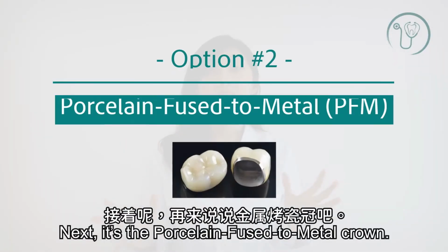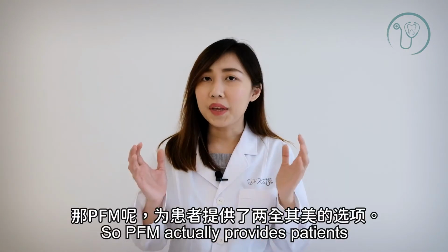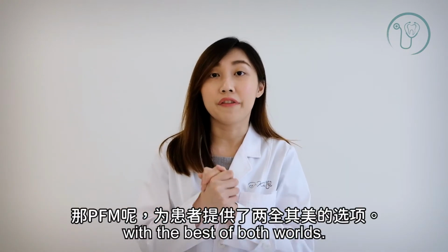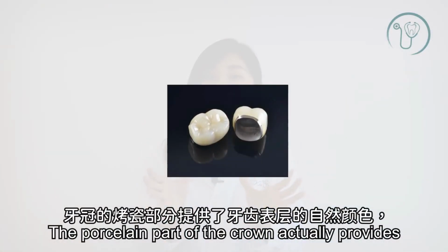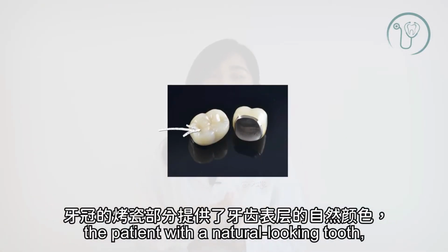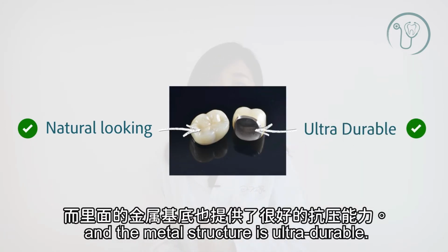Next is the Porcelain Fused to Metal crown. Let us call it PFM. PFM actually provides patients with the best of both worlds, porcelain and metal. The porcelain part of the crown provides the patient with a natural looking tooth and the metal structure is ultra durable.